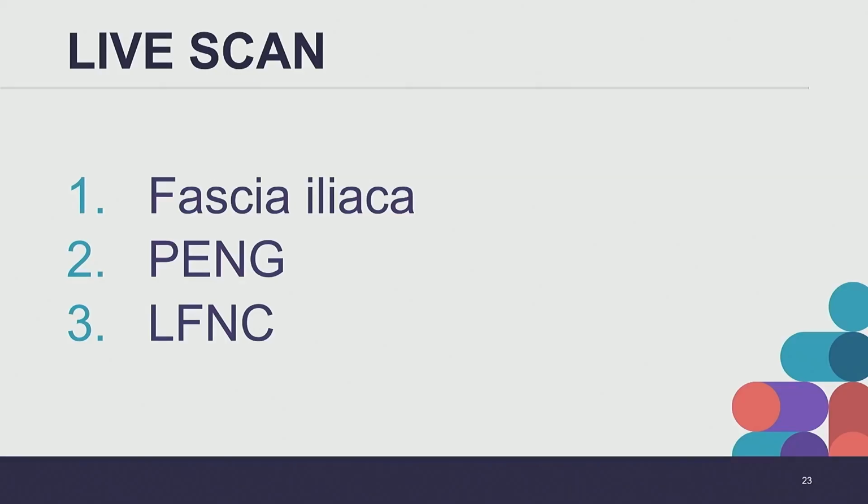That's the AIIS we talked about. There's the iliopubic eminence somewhere over here. And that hyperechoic structure here is the psoas tendon. And this is all iliacus muscle here. Now if I went a little too down, you'd start to see a bony structure that's the head of the femur. So that tells me that I'm too distal in the leg. If I come back up, now I have that continuous line of bone. That's the AIIS and the iliopubic eminence.